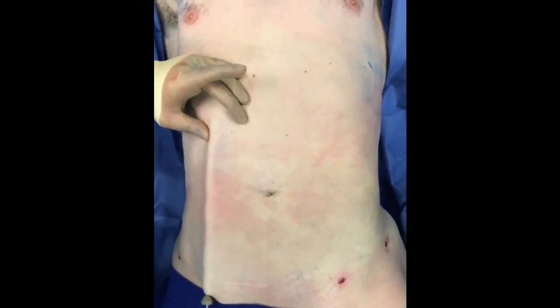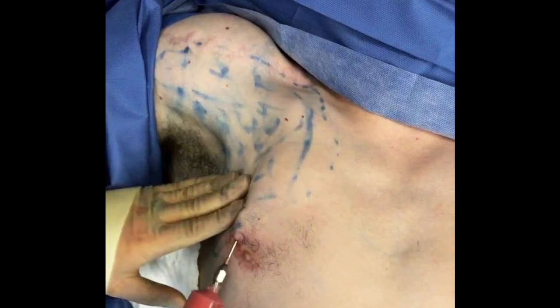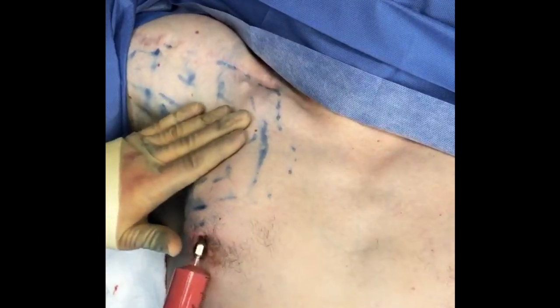Now we're doing some high-definition shaping with the ultrasound or VASER. What I'm doing now is injecting some fat into his chest wall in the areas that are deficient. It's going to be fat grafted.